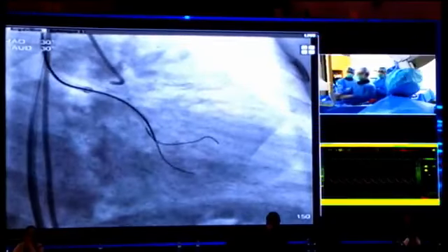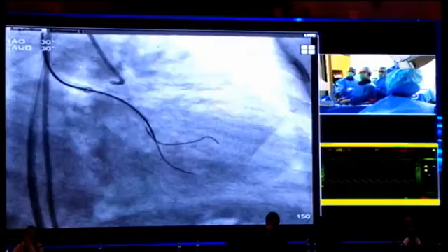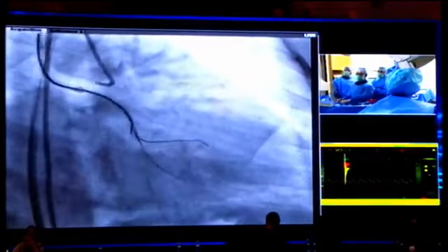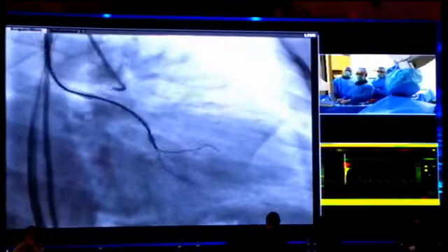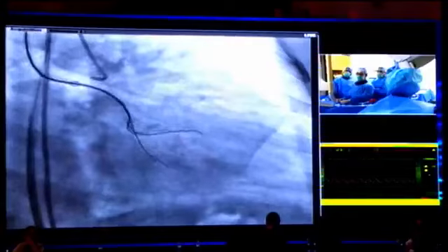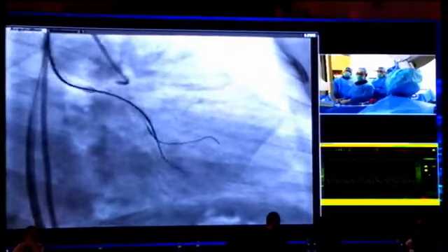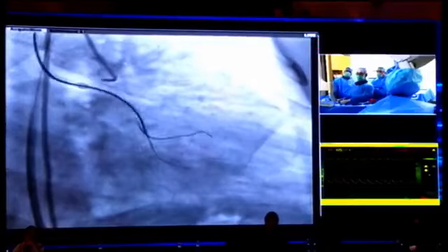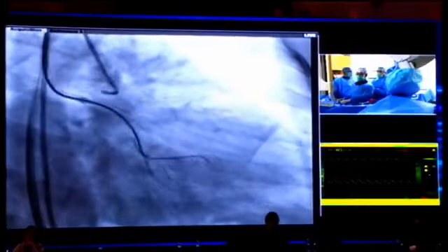So this route, this part, is it perforated or not? So my choice is to pass the first guide wire. I think this first guide wire is a Gaia second, and the additional one now is a Gaia third, which is a little bit easier than the previous.